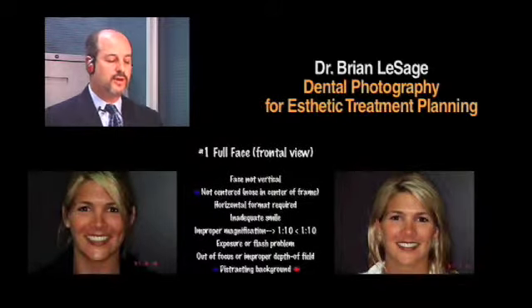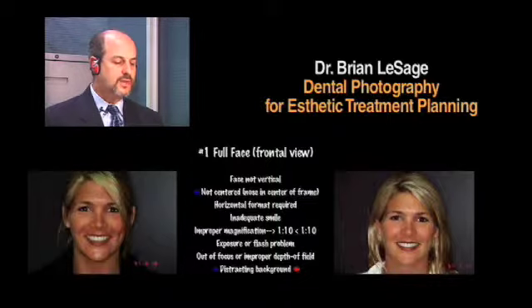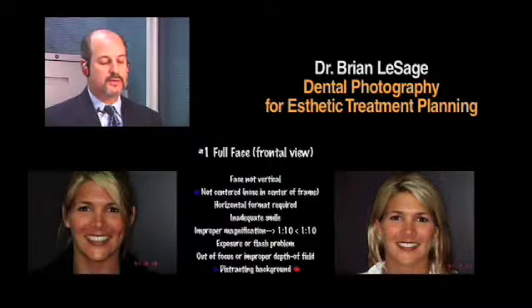So that criteria basically in the full face images, we'd like to have the patient's nose basically center the picture. So honestly, this picture on the left is okay. The picture on the right is probably better. All right, we're just a little closer. You don't really want to see the shoulders, but we really like the nose to split the X and Y plane pretty well. A nice smile, nice pleasant smile.